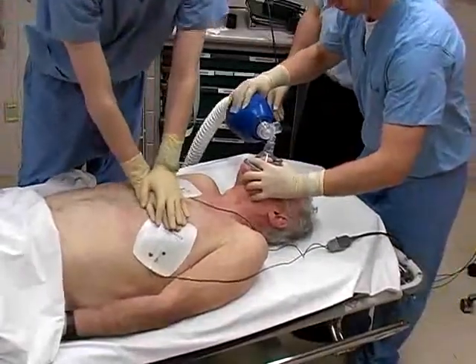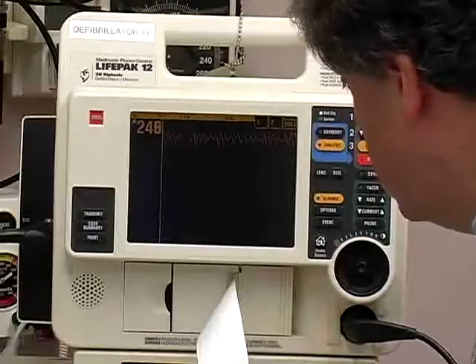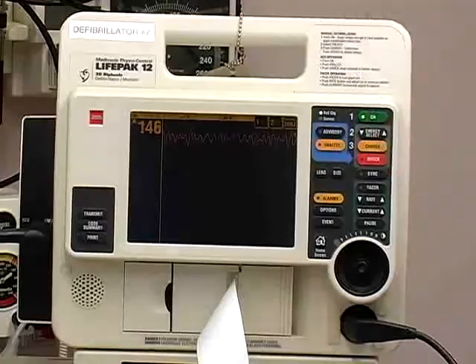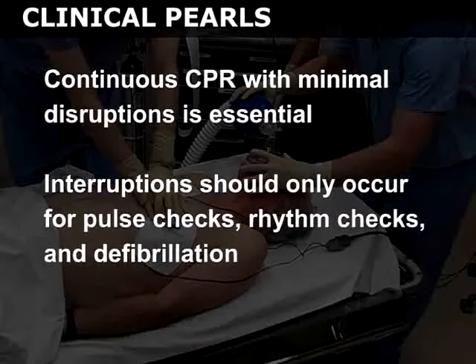Immediately resume CPR after the countershock and continue for 2 minutes before reanalyzing the rhythm. Continuous CPR with minimal disruptions is essential. Interruptions should occur only for pulse checks, rhythm checks, and defibrillation.